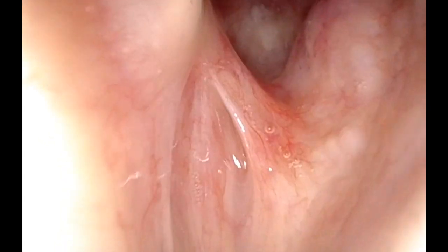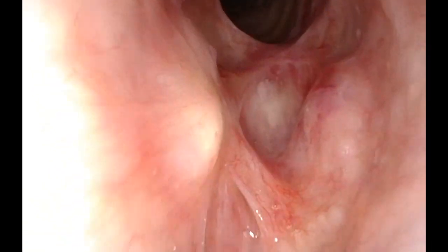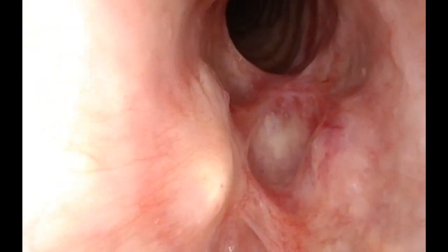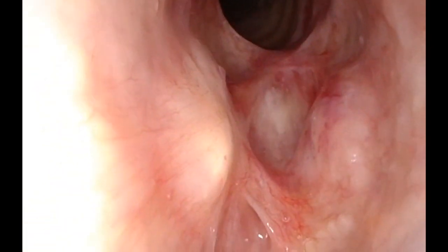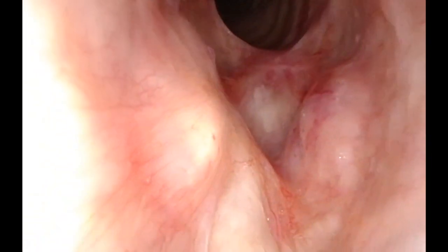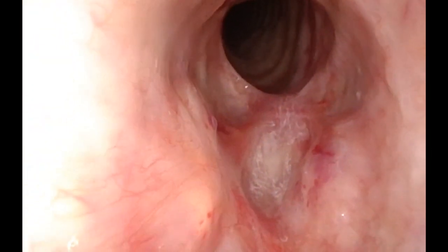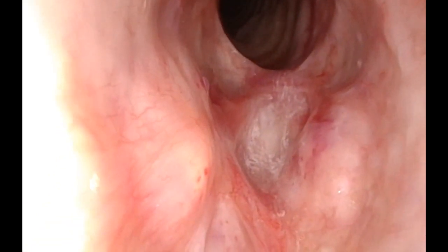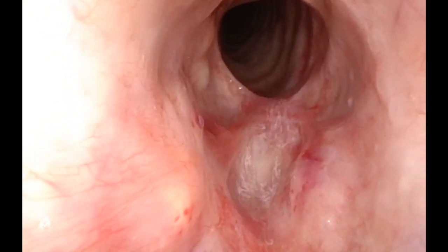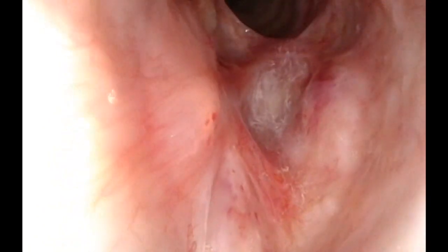During the procedure I will inject the entire inflamed area by advancing my needle circumferentially around the front and side walls of the subglottis. In some cases I even advance the needle through the lumen into the stenosed back wall, which is not necessary in this case.